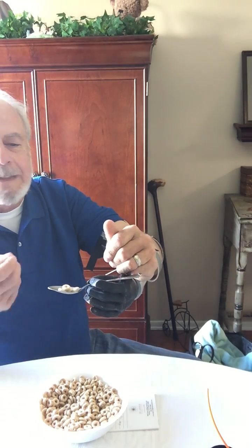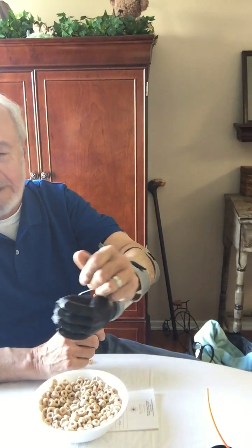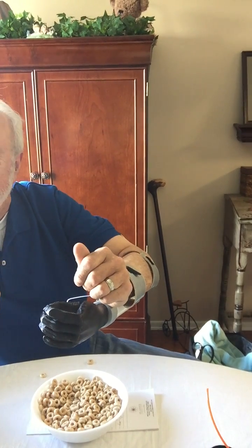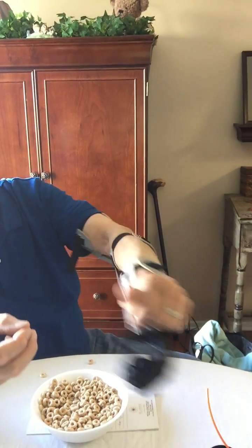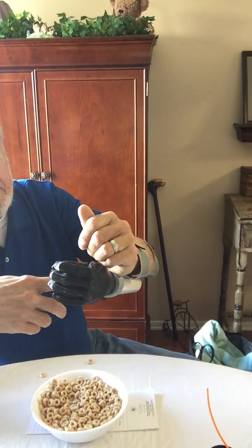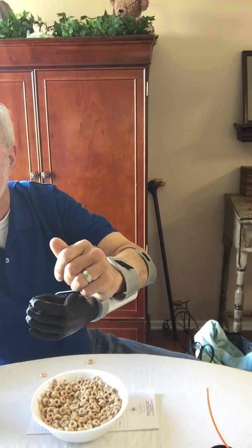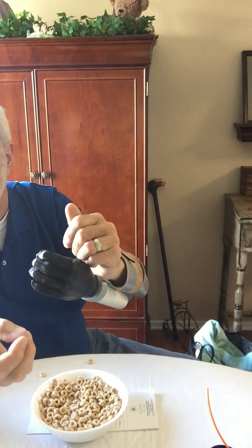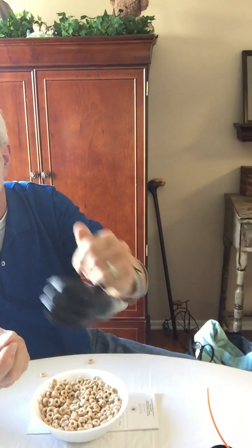And you may not notice that your terminal device is going to be dependent on, oh, by the way, you can learn to practice with the terminal device like the recipient has to do. You'll forget that when you extend your arm, you're going to be dropping things until you get used to the idea. And so the emulator is going to be useful for a training tool, we believe, for clinical people when they are presenting a prosthesis or a new kind of terminal device to a patient or a recipient.